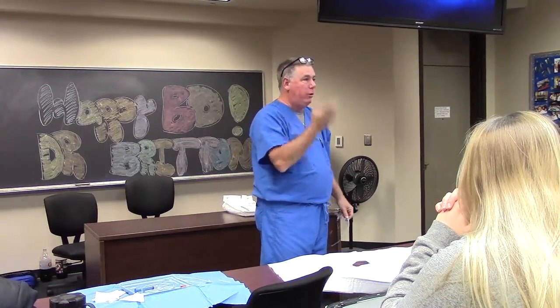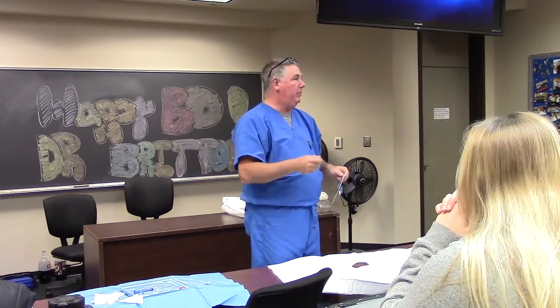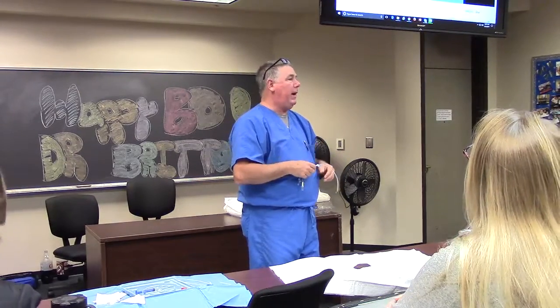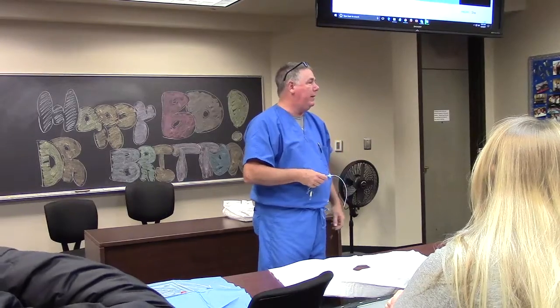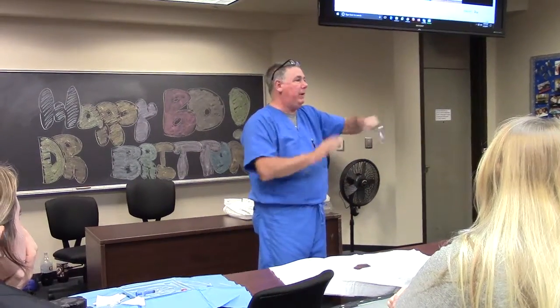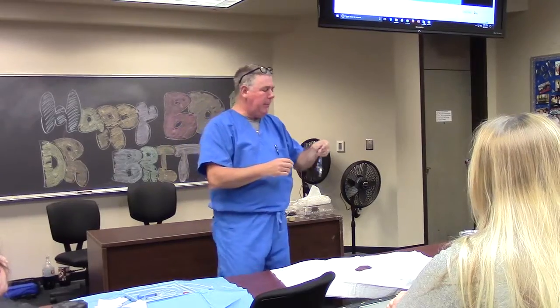It's like endotracheal tubes. Always hold on to things or suture it in place, because somebody's gonna jostle it. The x-ray tech, as she's trying to get this film or the reader behind the person, could grab this thing and just pull it right out. So don't do that. Now to suture it in place, it has a couple of little things here.